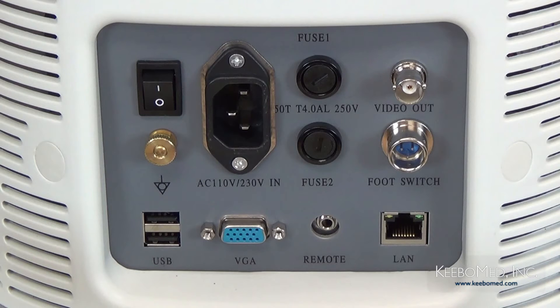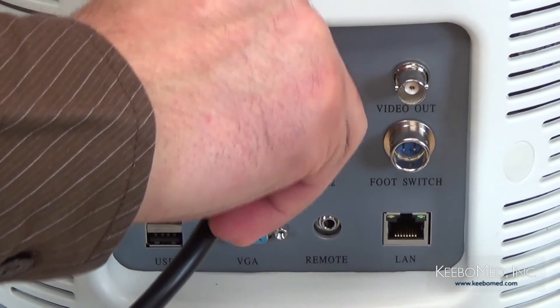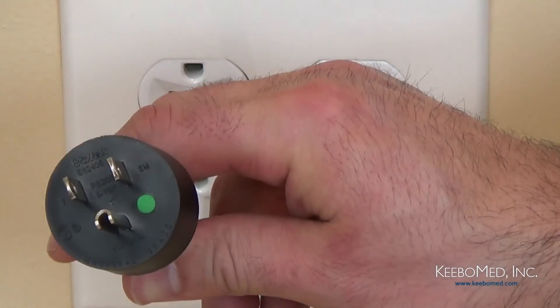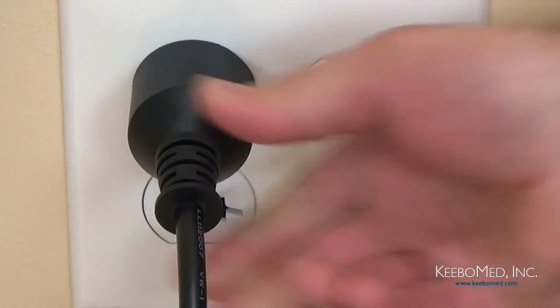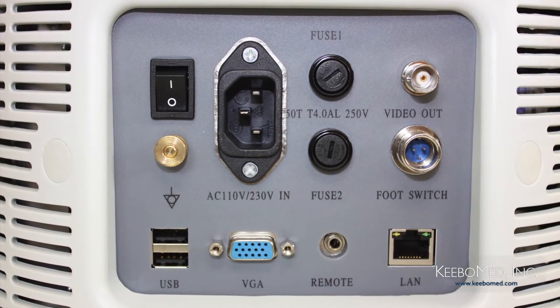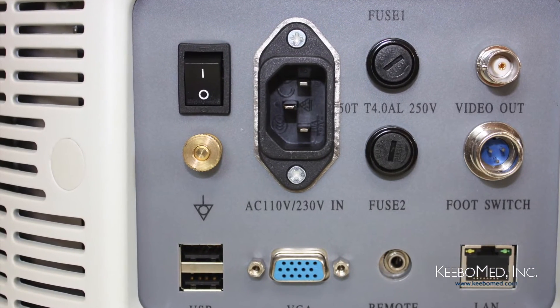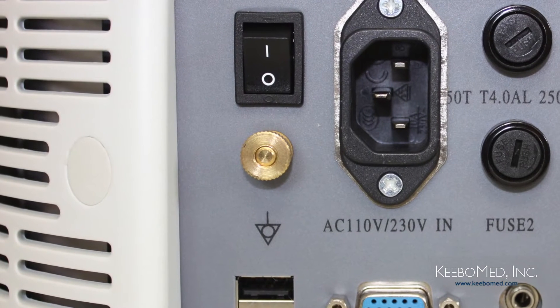Follow these simple steps to connect electricity to the ultrasound. Step number one, connect the plug of the power cord to the AC power in socket at the rear panel of the system. Step number two, connect the other end of the power cord into the AC power supply socket. The AD300 also has an equal potential terminal that is used to equalize the grounding terminals between the system and other electronic equipment that may be connected to the system.